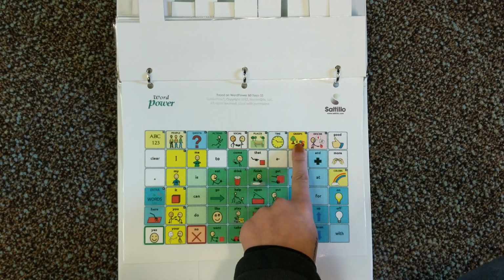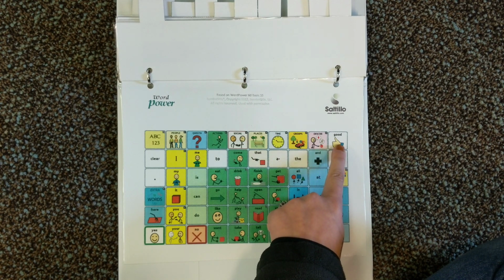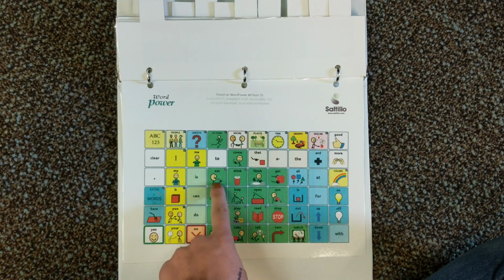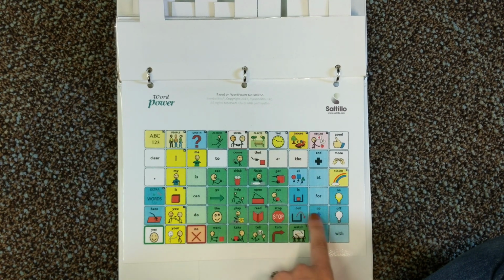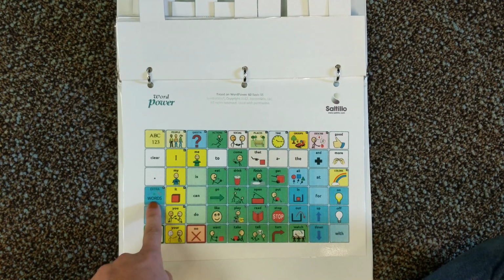This is typically all of your nouns. The describe page has a lot of your descriptive words, adjectives, and then on here, this is a lot of your most common verbs, actions that your kiddo would use. These are your extra words, like your prepositions and such. There's also an extra word page that has more of those.